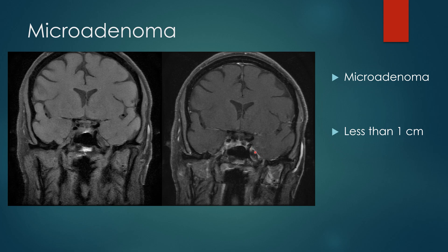A useful trick: if you think there might be a microadenoma and you're not sure, look at the pituitary infundibulum. Wherever there is pathology in the gland, it replaces normal tissue and you'll see deviation of the stalk to one side of midline. In this example, because there's a left microadenoma, the stalk is slightly deviated to the right at its insertion. As the lesion gets bigger, the stalk deviates even more.